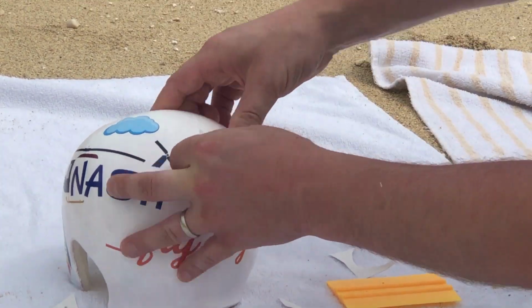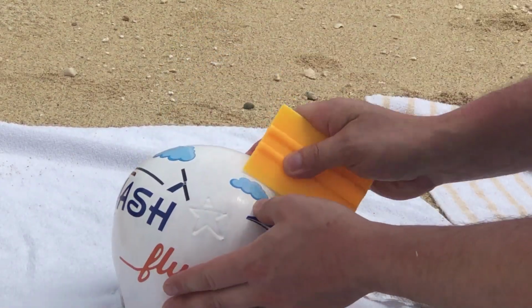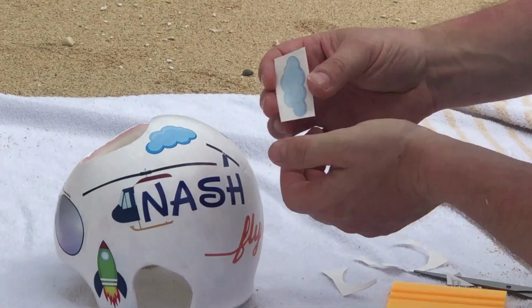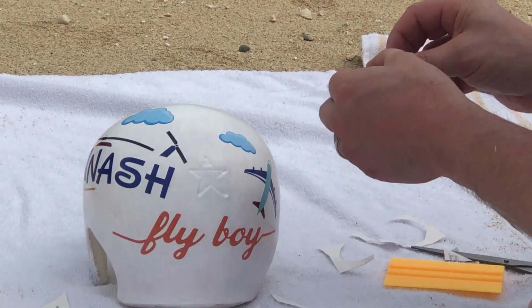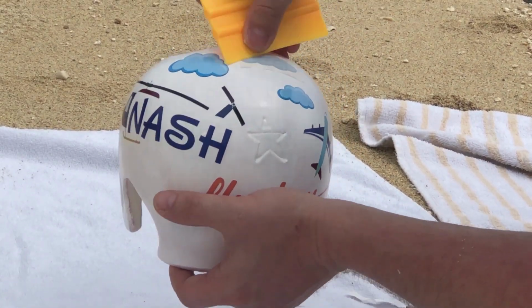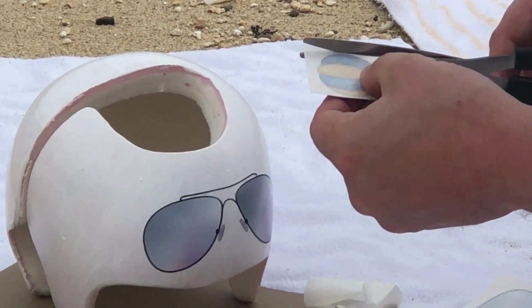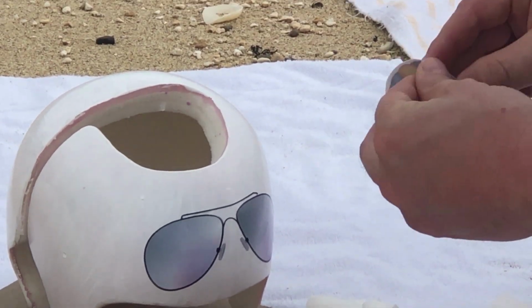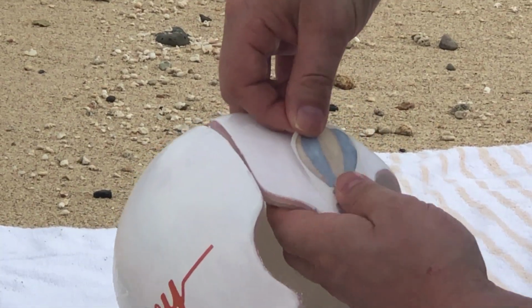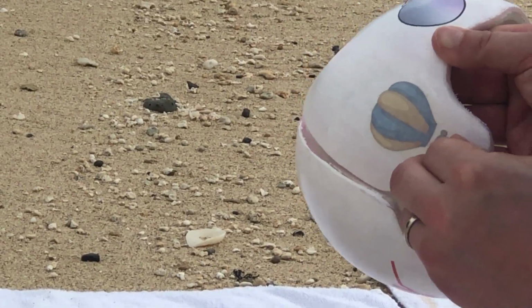We have found that a thin coat of Mod Podge dries to the touch in about 5 minutes. 5 coats can be more than you have time for the first day if your child is wearing the helmet 23 hours a day. If you can get 2 coats on the first day, the rest can wait till tomorrow. Mod Podge does not want to be soaked in water, and see the video or the links below for recommendations from other parents on how to clean the band and remove any smells.